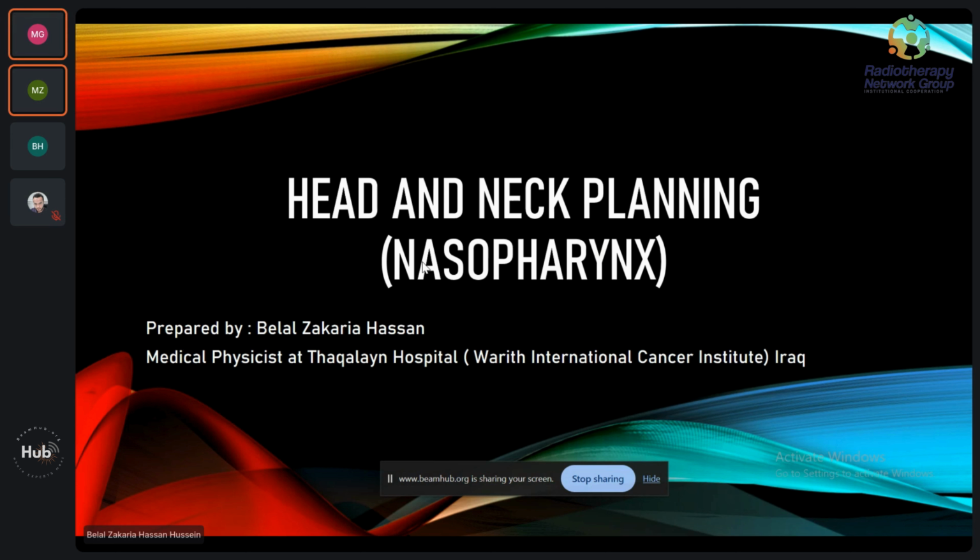We use in our institution 3 millimeters for margin, but this is institutional from site to site. Maybe it's according to the setup positioning before the radiation, before every session, and for the DRR and the cone beam CT that we do for the patient before every session. Oh, perfect. Thank you.